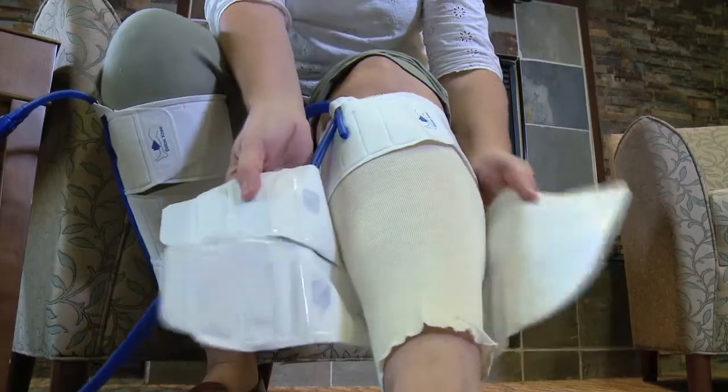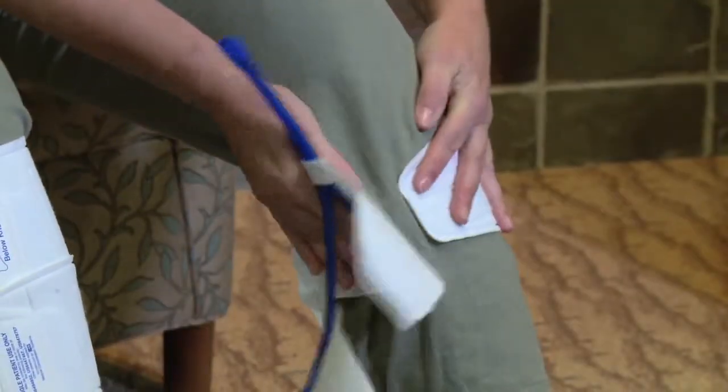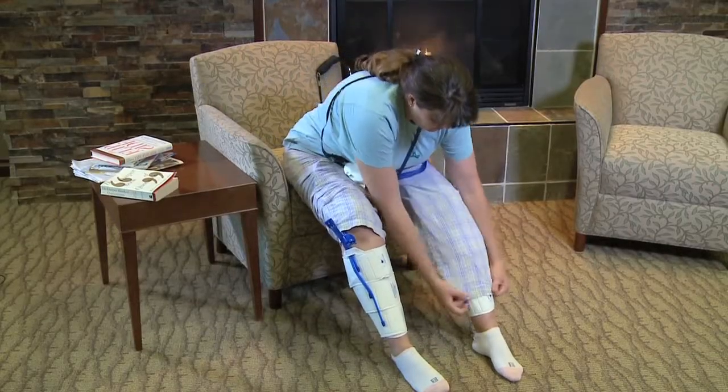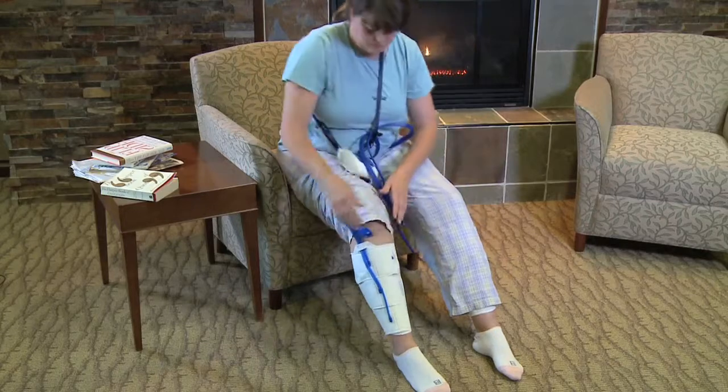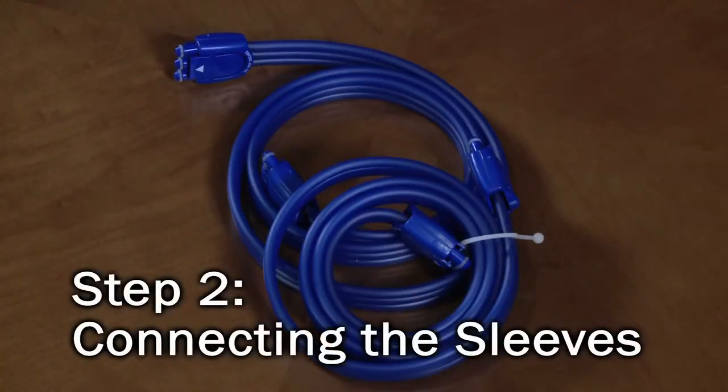The sleeves can be worn over simple cotton stockinets, thin pajama bottoms, or tube socks. They may also be worn under sweatpants or pajama bottoms to hide the tubing. Step 2: connecting the sleeves to the device.